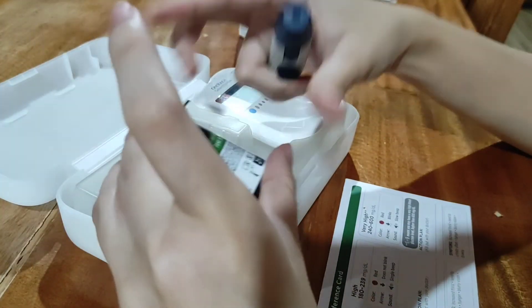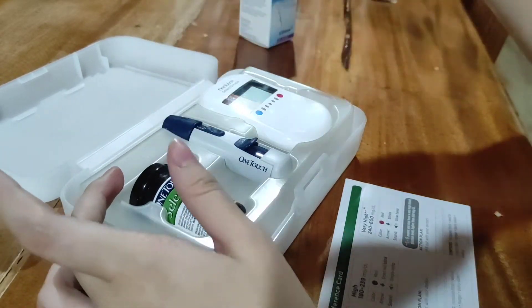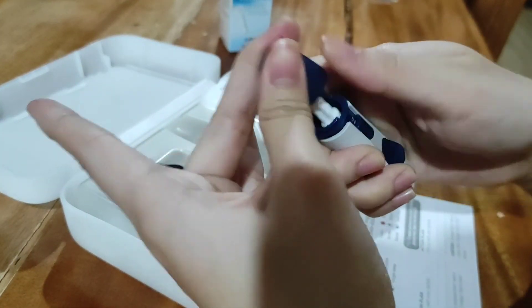We're done with our glucose monitoring. That's it guys, that's easy! Just yan — kumuha ng blue clothes, kunin na natin yung ating materials.